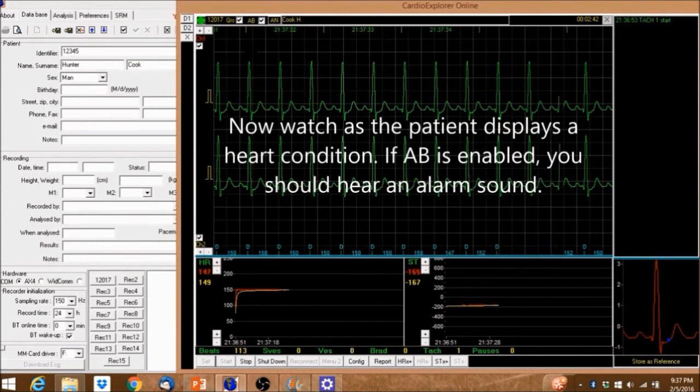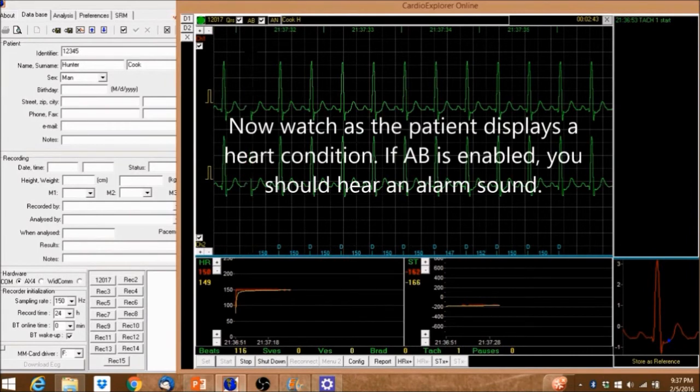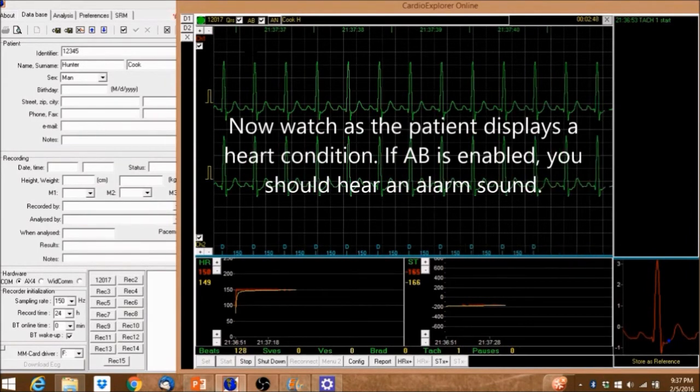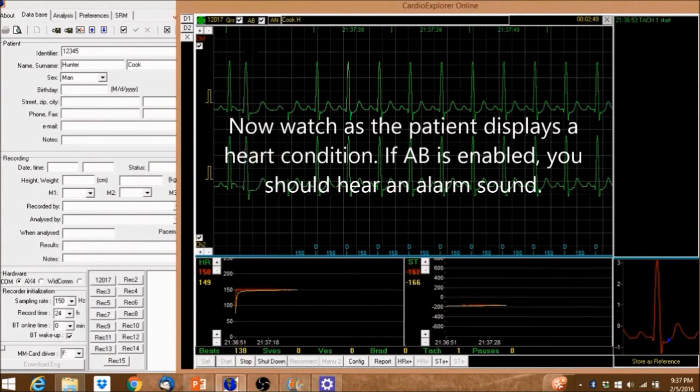Now watch as the patient displays a heart condition. If AB is enabled, you should hear an alarm sound.